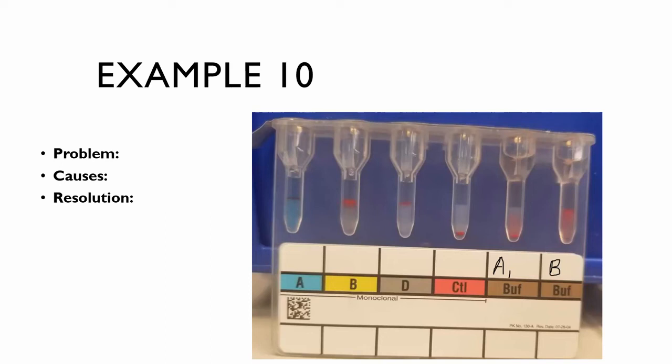Rouleaux will show in your reverse type if the patient has multiple myeloma or Waldenstrom's macroglobulinemia, diseases that make you produce a lot of plasma proteins, which can make your cells really sticky. It makes your plasma sticky pretty much. So you can have extra reactions due to those plasma proteins that cause problems in your reverse type. So this might be Rouleaux.